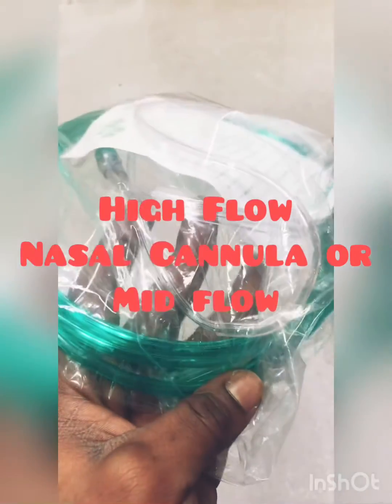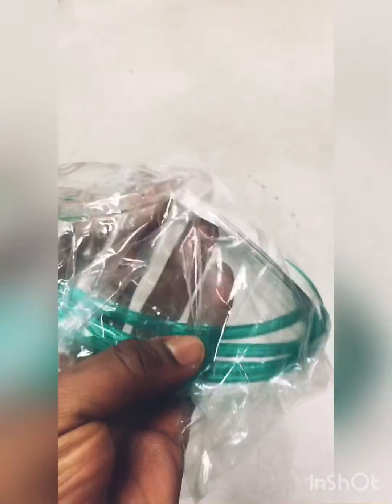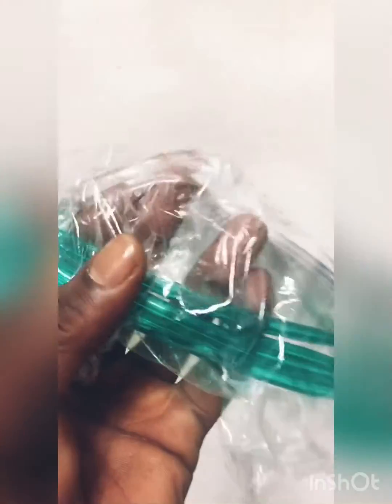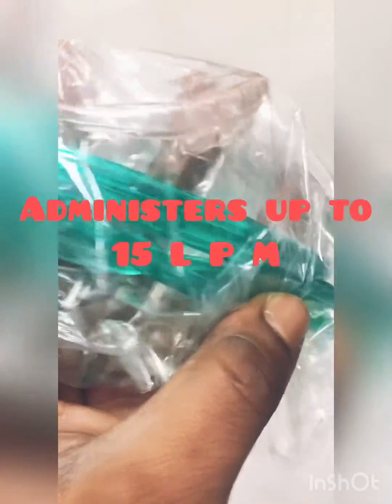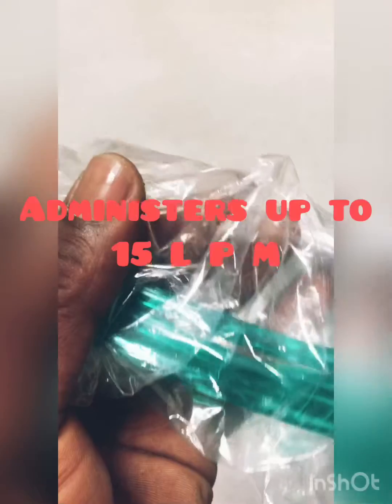Welcome to our respiratory world. This is our high-flow nasal cannula, or mid-flow setup — I've heard it called both. You can see the diameter on the tube; it's a little thicker. The bore of the hose for the nasal cannula is a little bit larger, which allows us to have a higher flow.